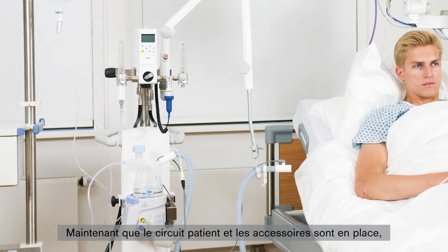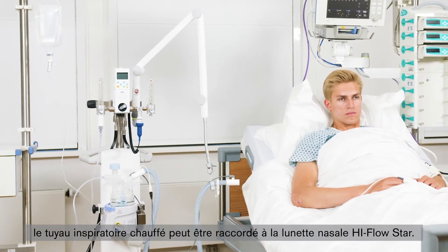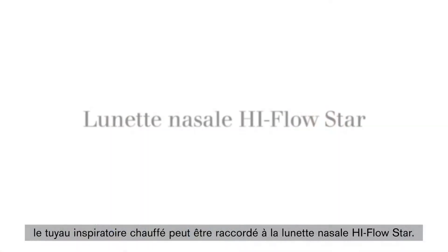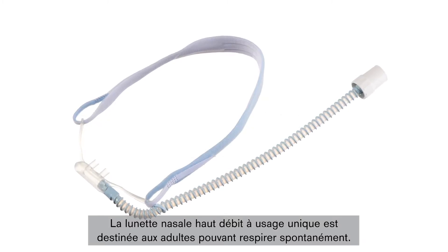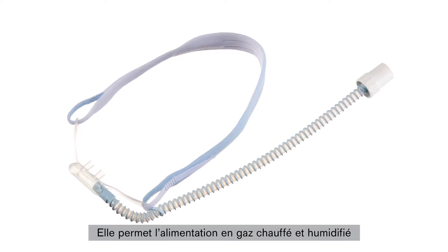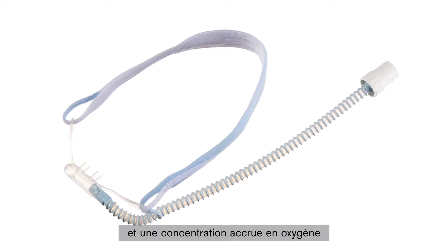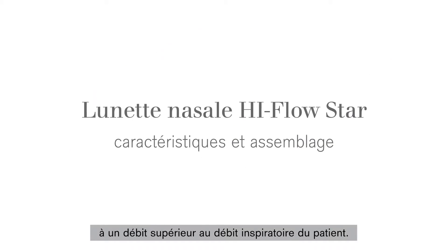Now that the breathing circuit system and accessories are in place, the heated inspiratory hose can be connected to the High-Flow STAR nasal cannula. The single-patient high-flow nasal cannula for adults who can breathe spontaneously is used to provide patients with a heated, humidified breathing gas supply with an increased oxygen concentration at a flow that is higher than the patient's own inspiratory flow.